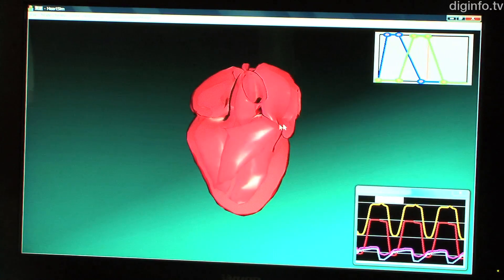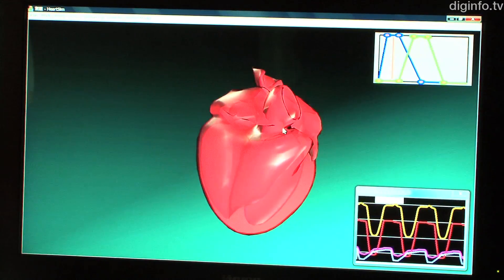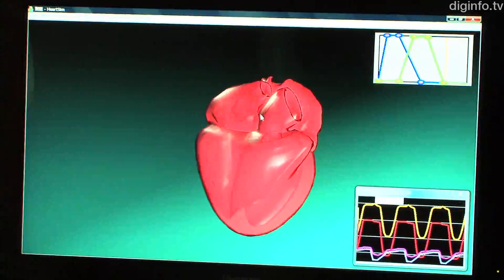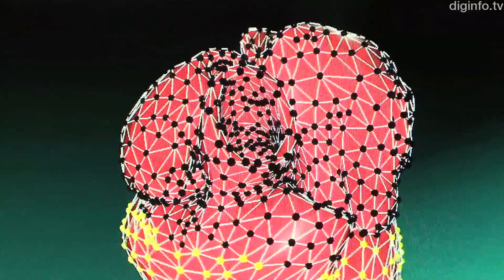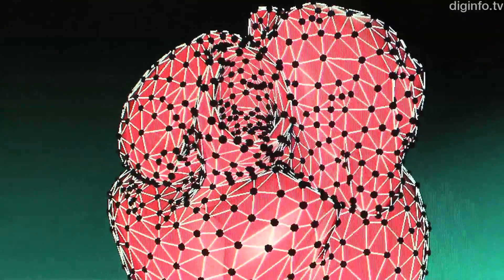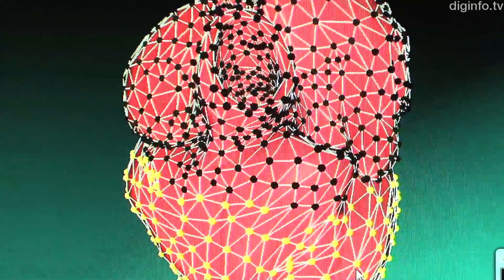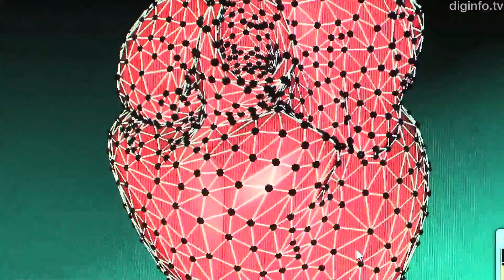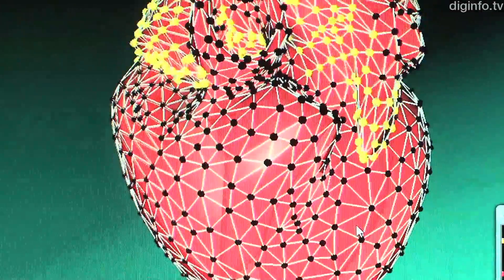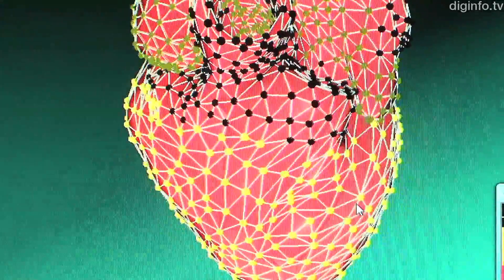This simulator can represent the complex pulsation of the heart. It is being developed by a group including members from the National Cerebral and Cardiovascular Centre and RICAN.